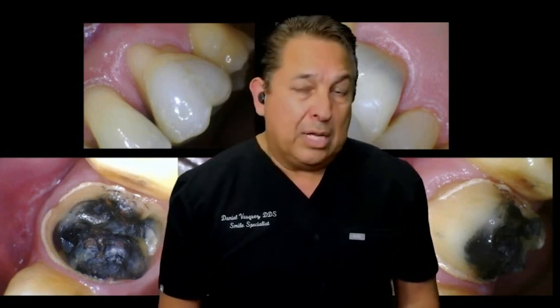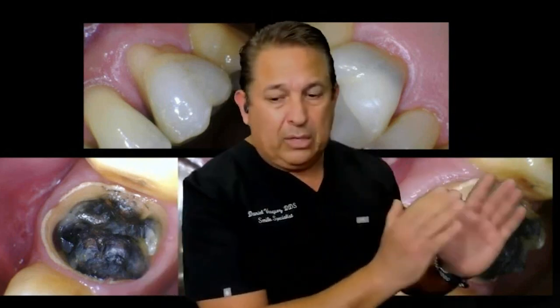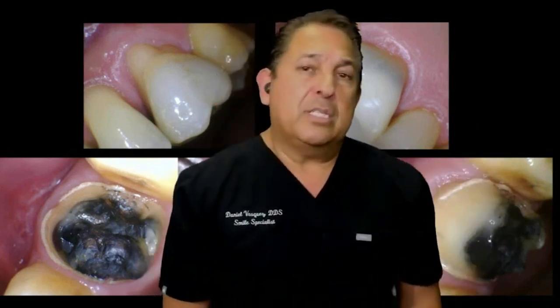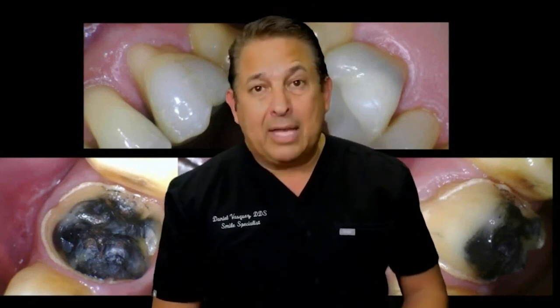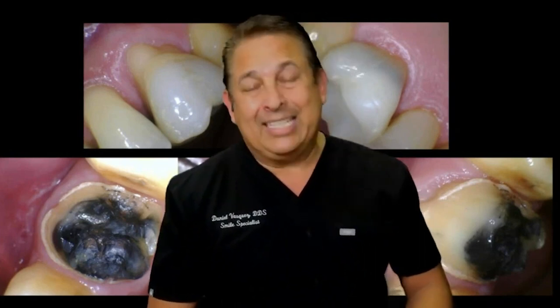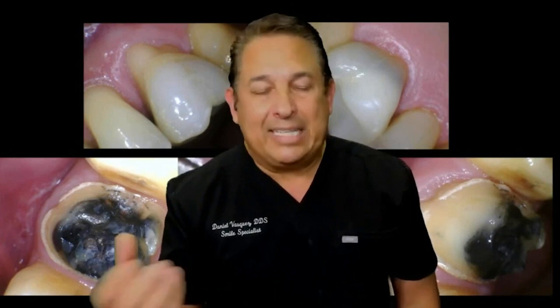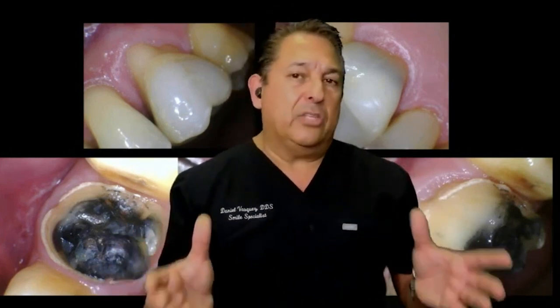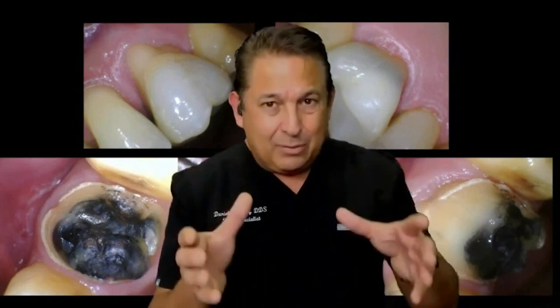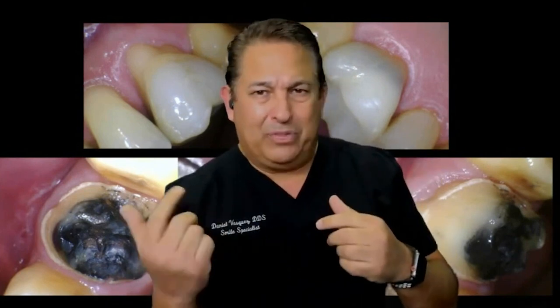we don't do that. I don't do thick margins or shoulders. That's old school. Okay, well, today we're moving to the new materials. Today, there's a lot of strong materials like Emax, like lithium silicates, like Tessera, Vita Suprinity. And today, one of the most beautiful materials to be milled is zirconia. So all these materials, okay, they're very strong. So you don't actually need to have a shoulder or a thick chamfer.